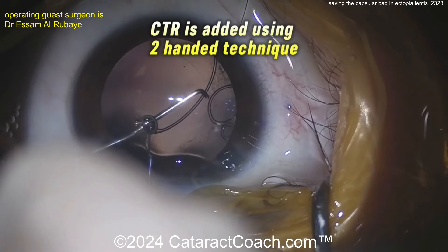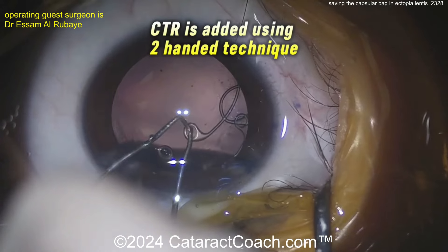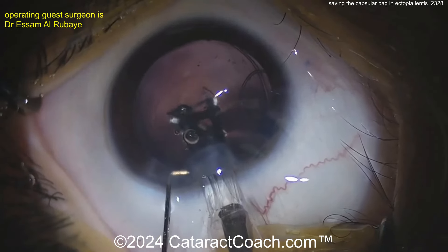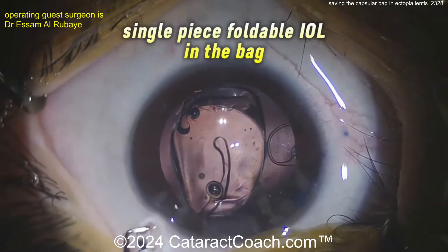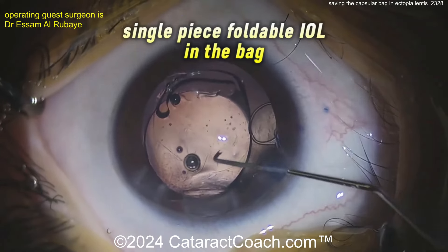Using a Sinsky hook to grab that last eyelet and get it delivered in the bag very gently. Making sure they're not entangled with each other — the CTR goes in the capsular bag and this is going to help distribute forces evenly. At this point, you could put in essentially any kind of lens you want in the capsular bag.